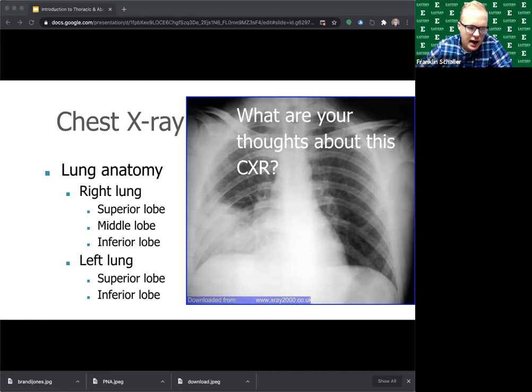And oftentimes when I am working clinically in the urgent care, when I walk up to a chest x-ray, I'm looking for that obvious opacity if I'm looking for a type of pneumonia. Will we sometimes have very subtle pneumonias that aren't showing up when I first evaluate it and the radiologist sees it later? Yes, that does happen, but I'm not perfect. The radiologist has more training and experience than all of us, and we will occasionally miss a subtle pneumonia, and that's okay.